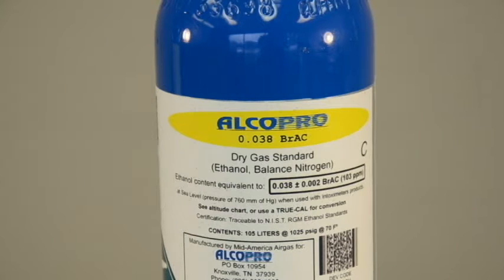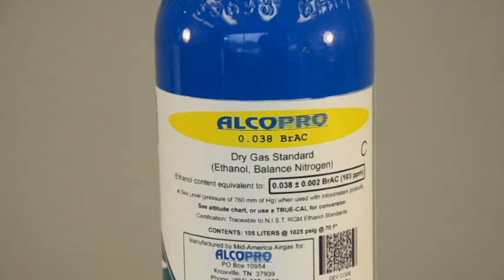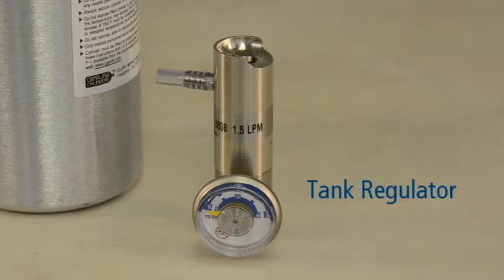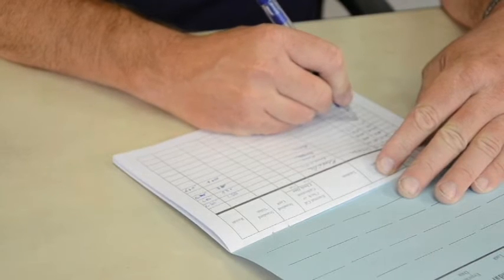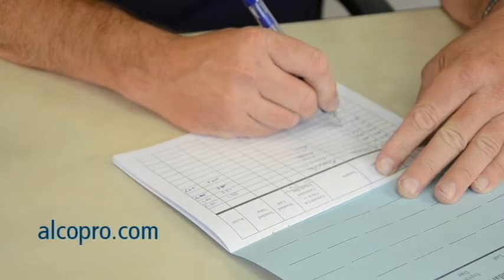The dry gas standard concentration can be located on the gas tank label. You will also need a tank regulator to attach to your dry gas tank. It is a good idea to keep a logbook of accuracy checks and calibrations performed on your device. You can purchase an accuracy check calibration logbook at alcopro.com.